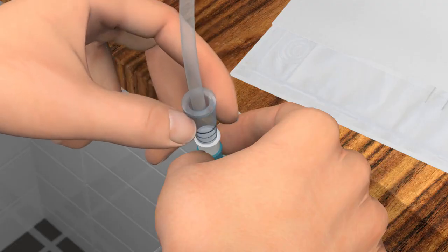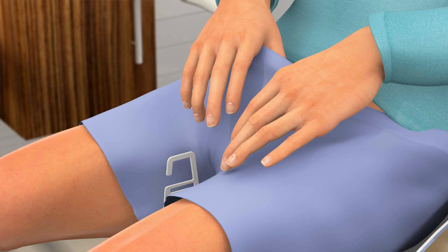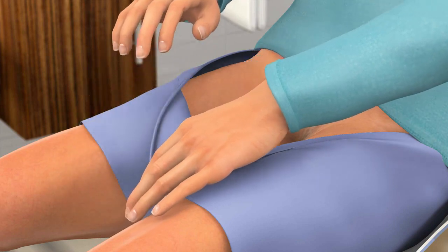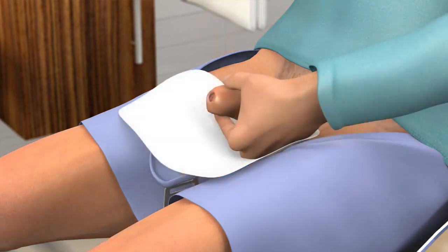Connect the urine bag to the funnel connector at the catheter and place the urine bag in a secure position. Pull your clothes down so you have free access when doing the catheterization. You may use a pantler to hold your clothes in place, and to avoid wetting your clothes, you may place a drape under your penis.